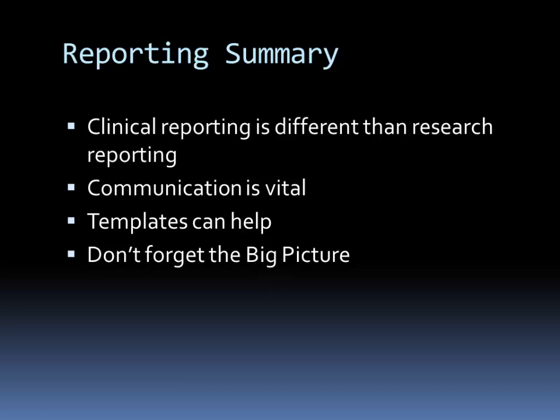So in summary, clinical reporting is different than research reporting and gives us the opportunity to convey our professional opinion in order to guide the clinical care of the patients. For that to occur, communication is vital, and using those 8 C's of effective reporting can be a helpful guideline in terms of taking all of the information, the complex information in a PET-CT scan, and distilling it down to a final message for the referring clinician.